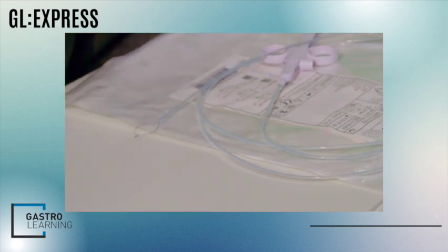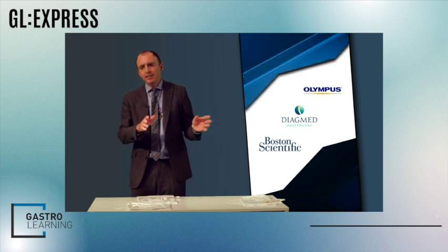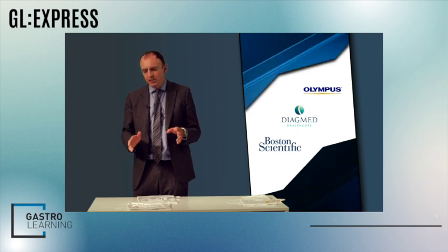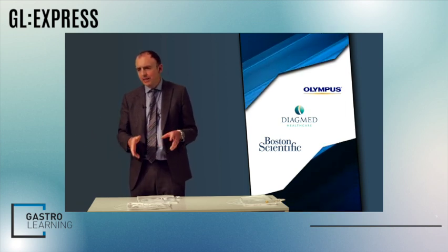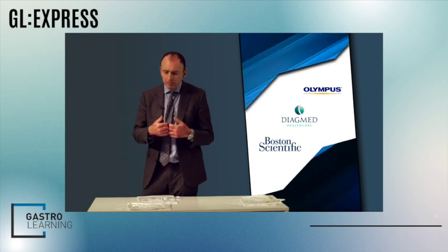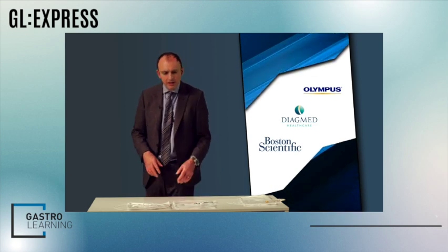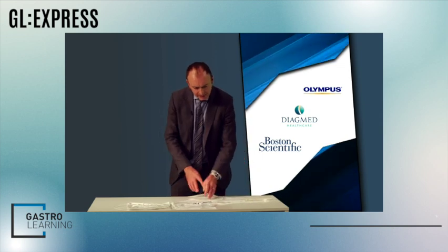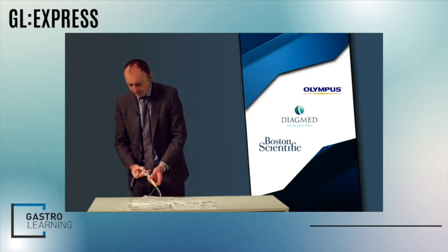This is perfect when you know you'll be coming across a mix of lesions — for example after a CT colonography with five different polyps of different sizes — you can use a snare that moves across the polyp size ranges. Other options include Boston's own snare and the Olympus Snare Master Plus. Then we move on to hot snares, and you saw me using the Olympus 20mm braided snare.